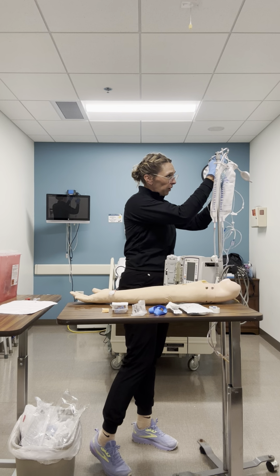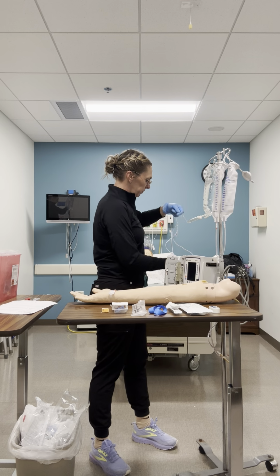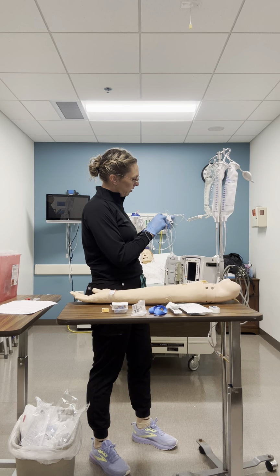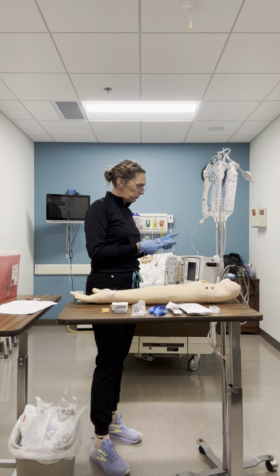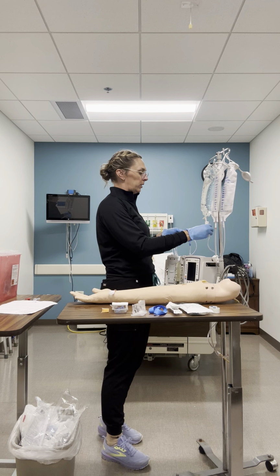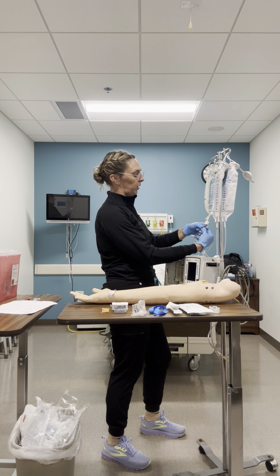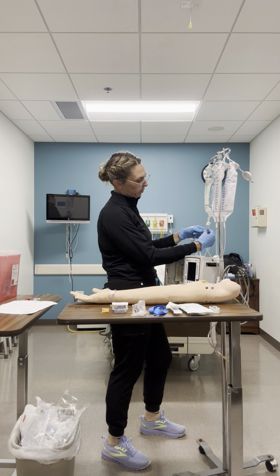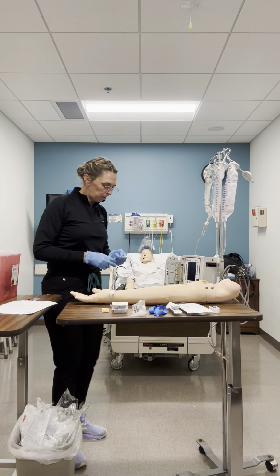I'm going to hang it while I prime it, just to make it easier. I am going to also make sure that my cassette is closed before I do that. My cassette is closed so that the saline does not come out. And then I'm going to squeeze my drip chamber. I want it to be just under halfway full. Maybe a little more, so somewhere in there. And then we're gonna go ahead and prime the tubing.